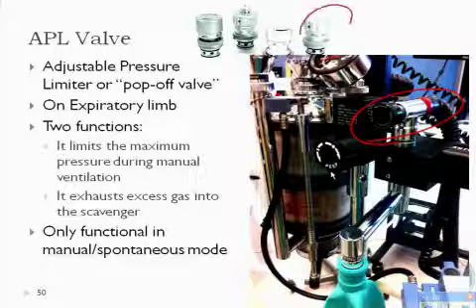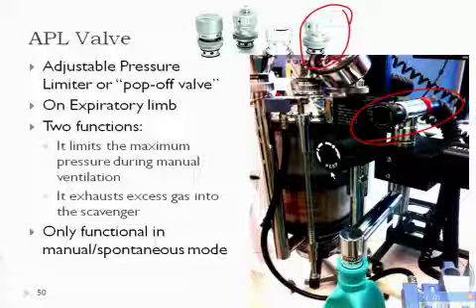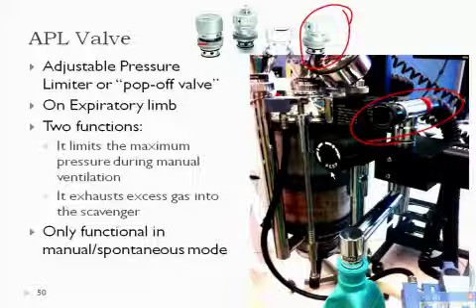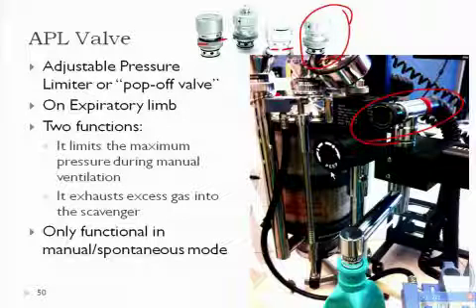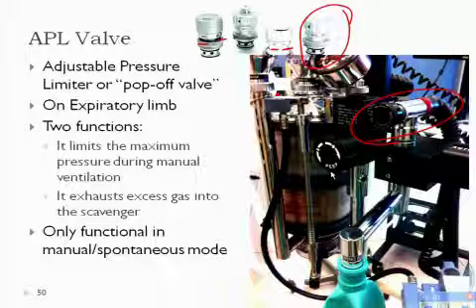These up here, you'll see these on a lot of the newer machines, and they do have numbers. All right, so it'll say minimum, it'll say spontaneous. Spontaneous means completely 100% open, or it'll give numbers. So 10, 30, 50. All right, these are all numbers that indicate basically a PEEP pressure. So if you set them on 20, then that's the equivalent of 20 a PEEP.